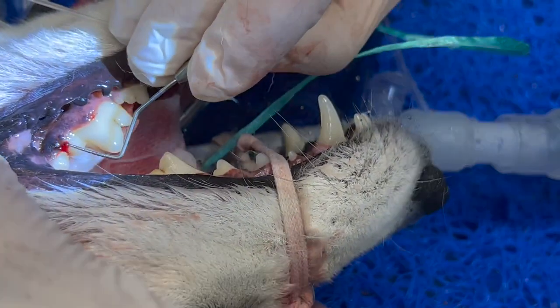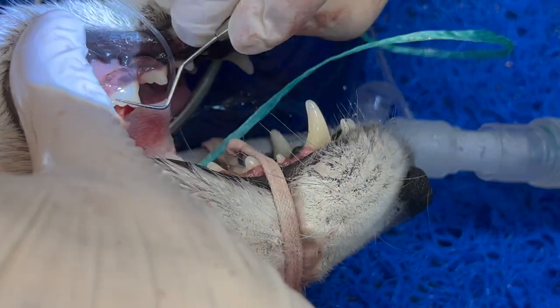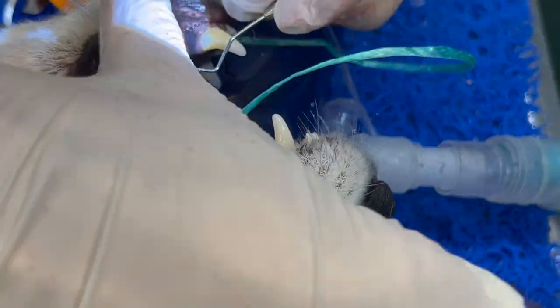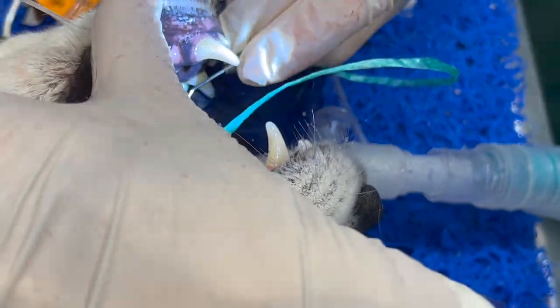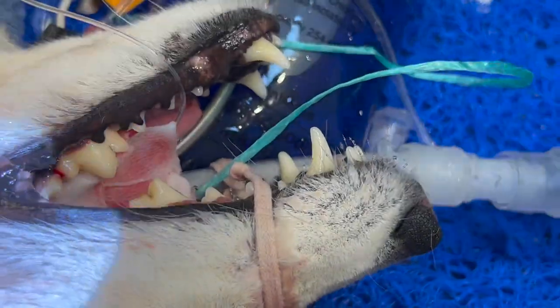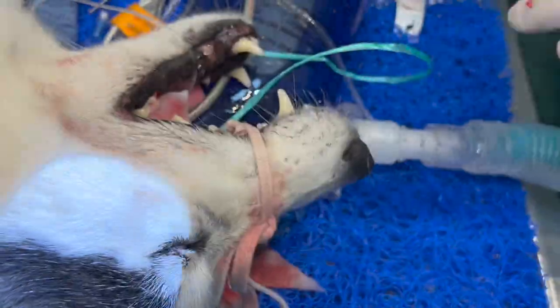We've got a small problem here which I'll clean out a little bit better. There's a small amount of decay — I'm going to try and clean that as best I can. And then we'll go to the other side. It's pretty much like at the human dentist.